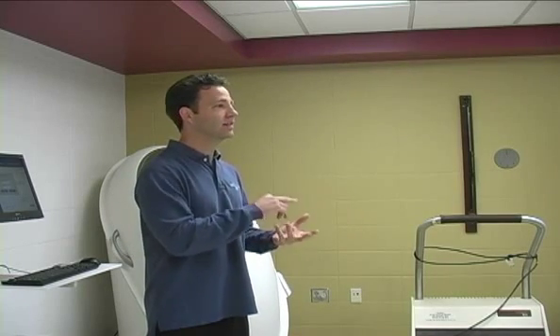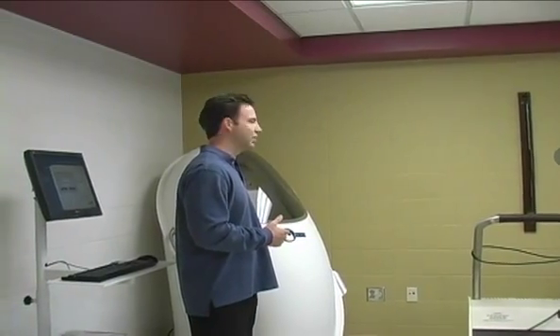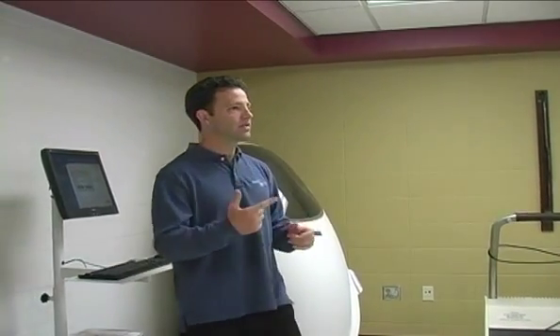So how they do this, and it's unique, only their labs, and if a university sometimes is affiliated with a hospital, do they have the money, the technique, the equipment to do it. So typically they would use DEXA for bone, they would use hydrostatic weighing or the BOD pod for fat mass and fat-free mass. Those are 3 compartments there. And then some facilities do, through deuterium dilution, they're able to calculate chemically total body water.